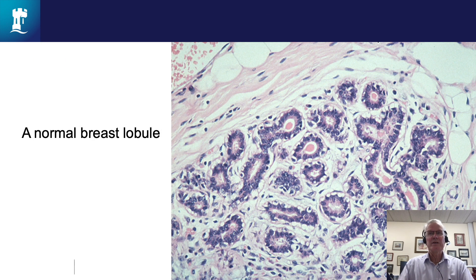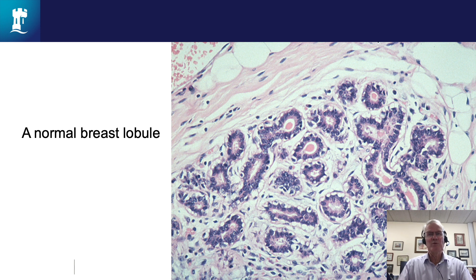Here's an example of a normal lobule. The circles you can see lined by purple and dark pink cells are the acinar cells of the normal lobule. There are some smaller paler cells surrounding those which are the myoepithelial cells, and the pale material around or between the circles is the stroma in the normal mammary lobule.